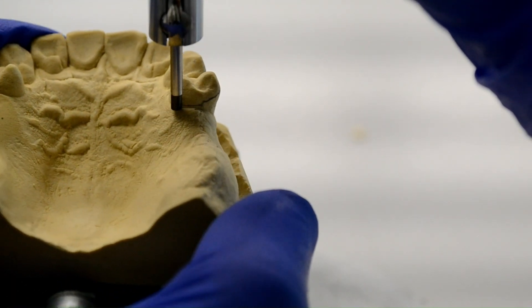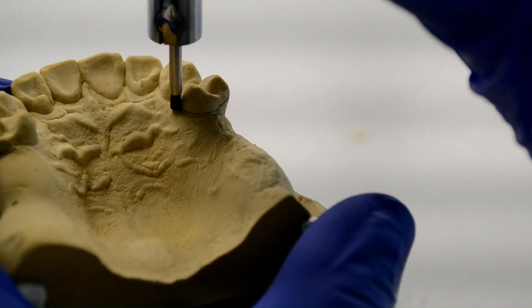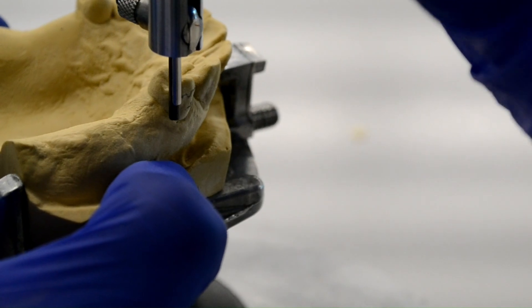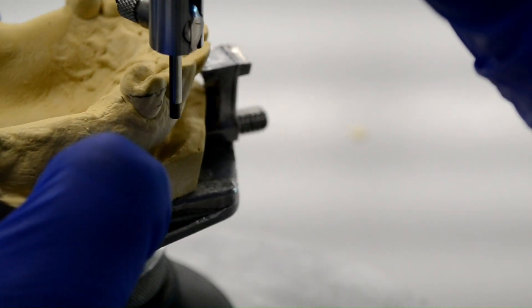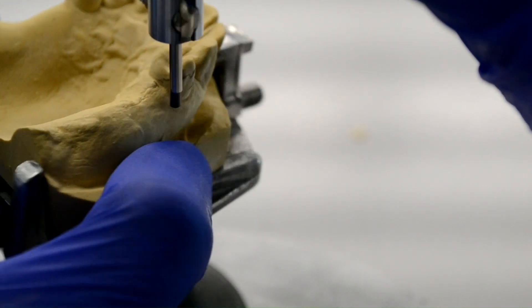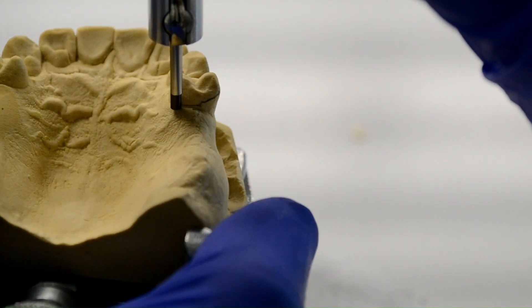In most cases, only abutment teeth needed by the RPD are going to need to have survey lines drawn on them, and anterior teeth are most likely only going to need to have their facial and proximal contacts surveyed.